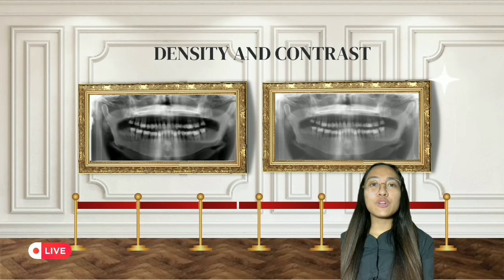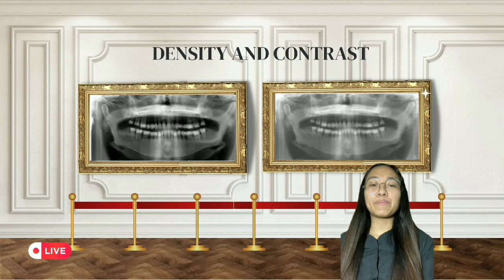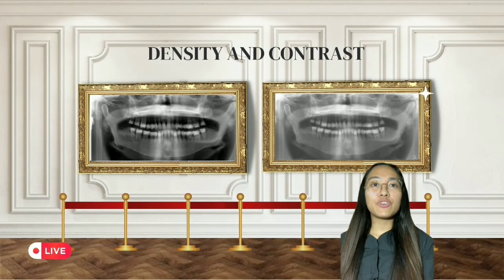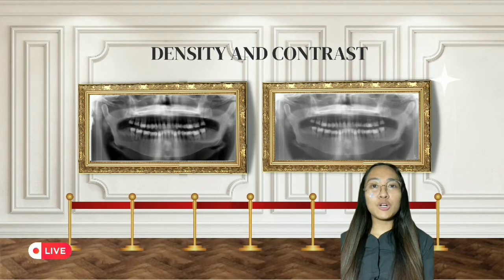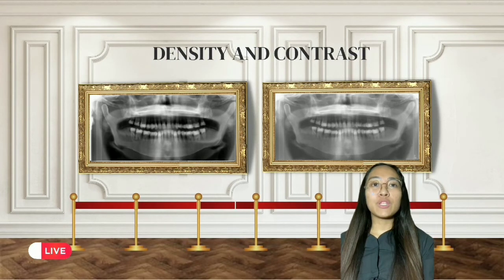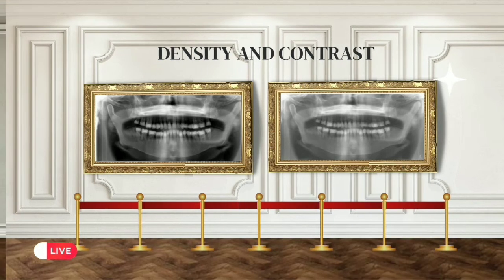Proper contrast on a panoramic image is also critical, especially when multiple anatomic structures appear overlapped. Ideal contrast on a panoramic image should allow for the identification of the junction between enamel and dentine in the molar region. Inadequate contrast may lead to problems with detection of unerupted or impacted teeth.